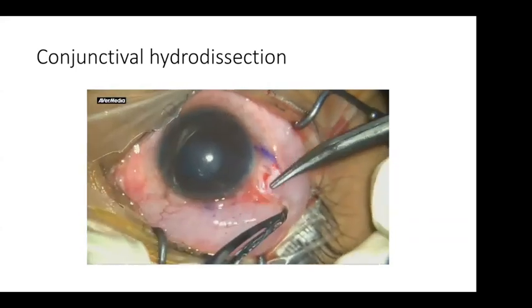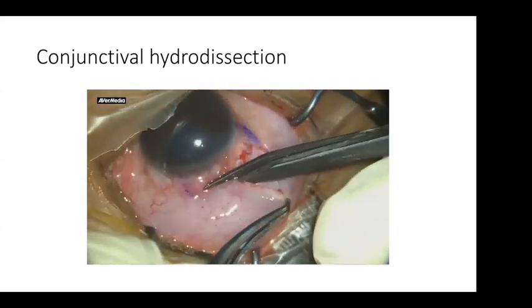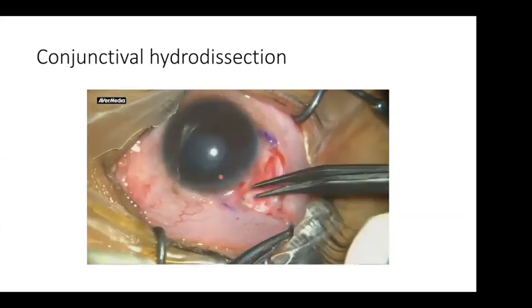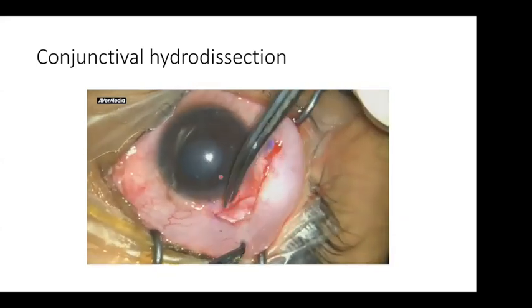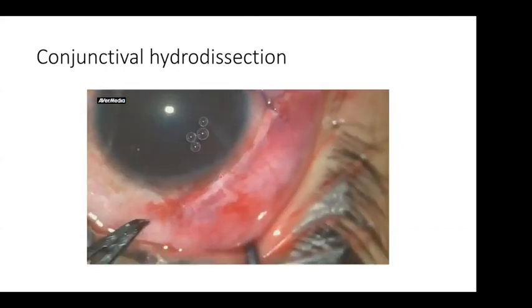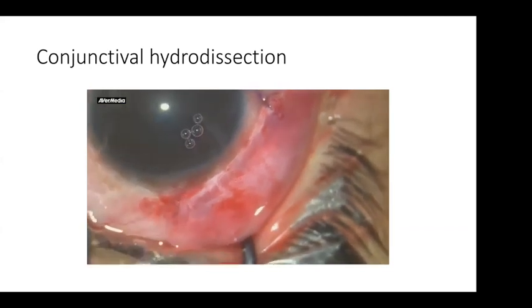So again, to harvest as much as possible of the conjunctiva. The conjunctiva itself is not bad, but the perilimbal conjunctiva is so much scarred. So again, I'm making use of this pushing effect to have more space. And at the conclusion of the surgery, it was easy to get this conjunctiva towards the limbus.